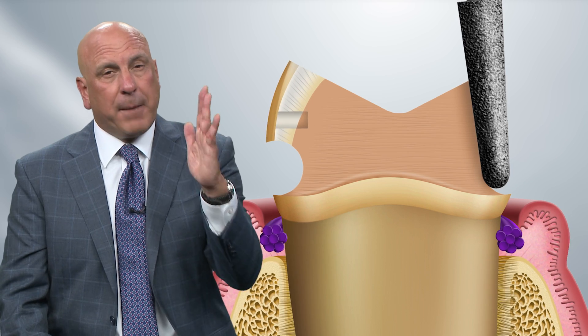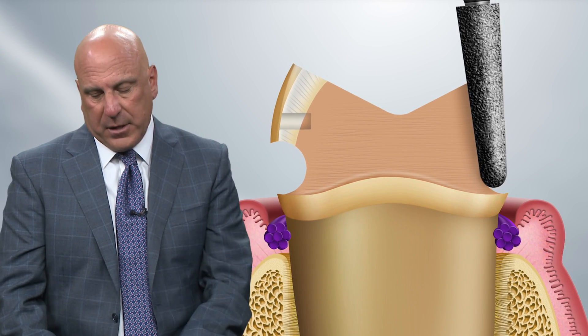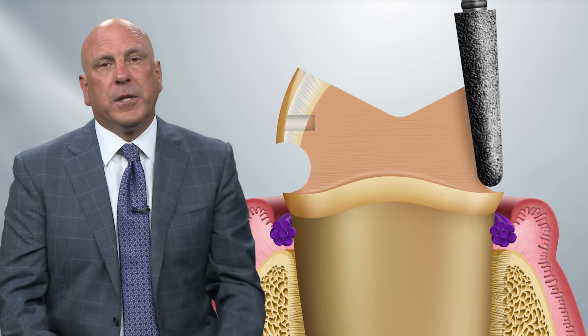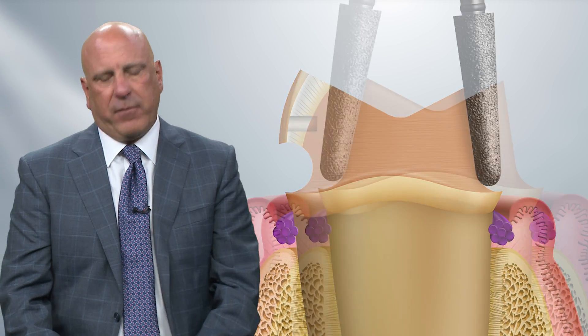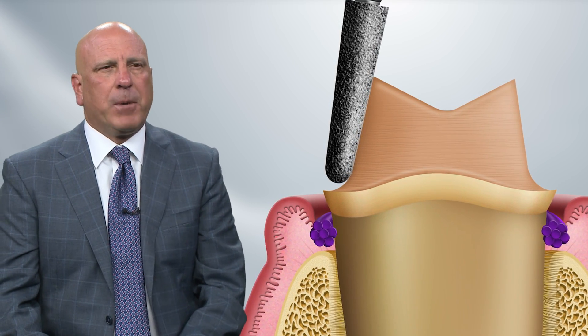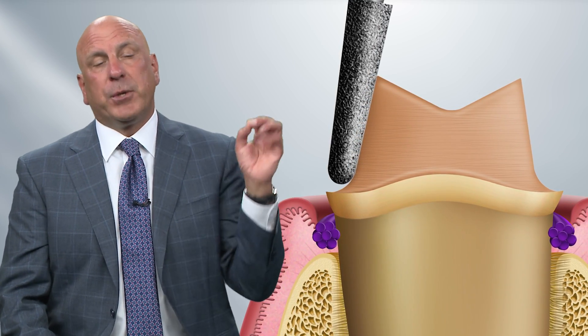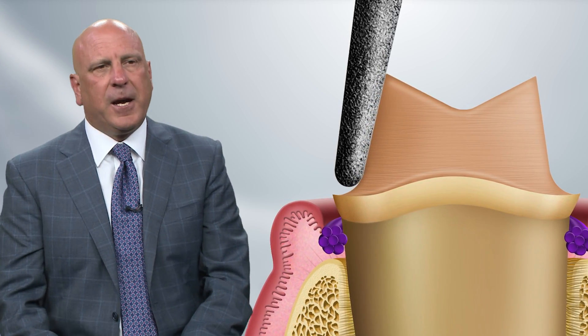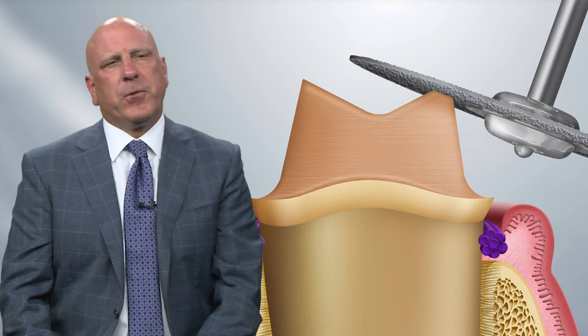There's taper built into that burr, so try to hold it straight up and down. It's actually much more difficult to undercut a single tooth than you think — provided there's not a large existing amalgam restoration in it. Go around and prep with the tapered 856 burr, and when you do this you'll end up with two sharp angles: one on the buccal and one on the lingual on the occlusal surfaces, as you can see here.